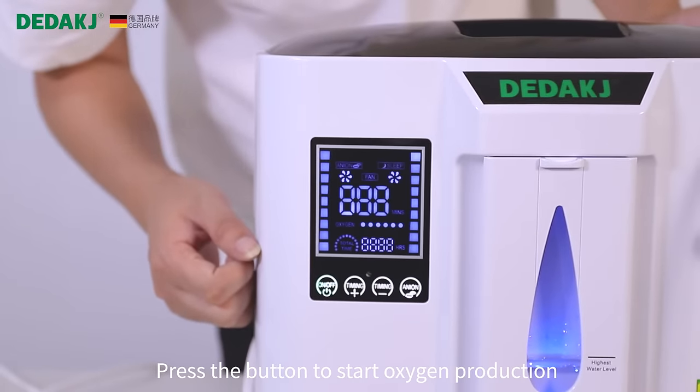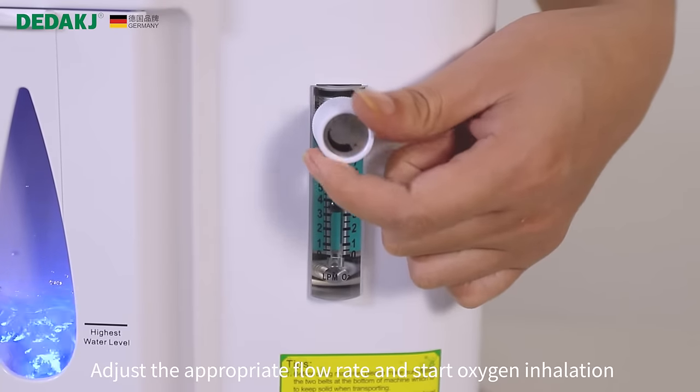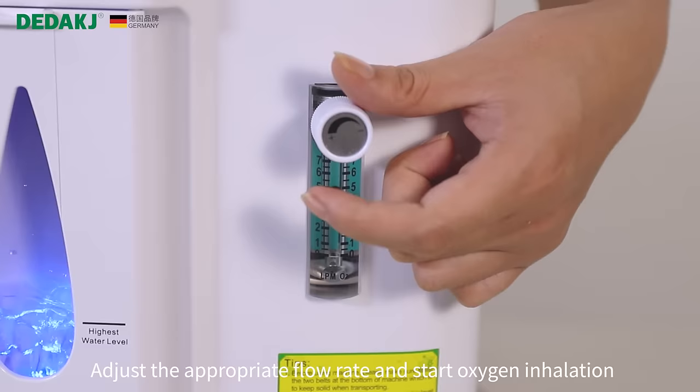Press the button to start oxygen production. Adjust the appropriate flow rate and start oxygen inhalation.